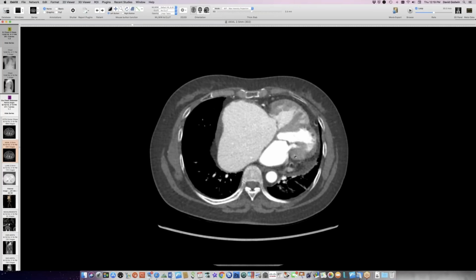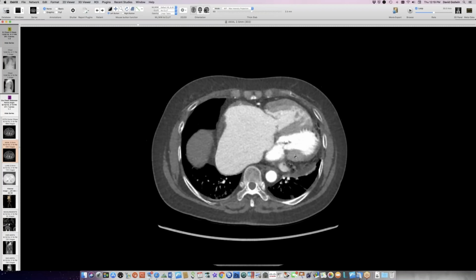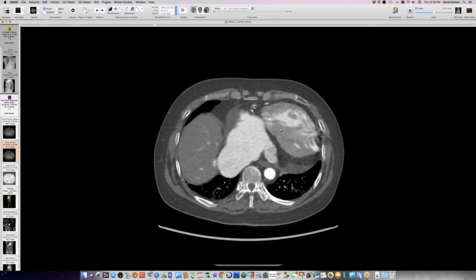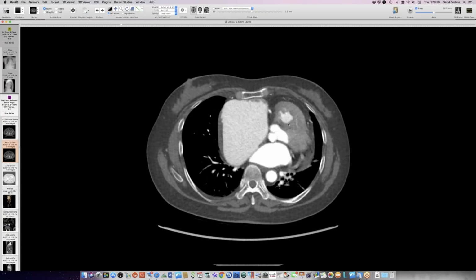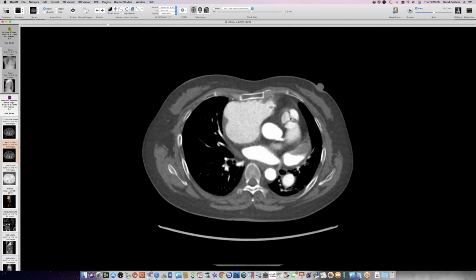I think you can see a jet of blood here from her mitral stenosis, and her tricuspid. So her tricuspid valve is thick, doesn't open all the way, and she's got all this hypertrophy, I think, of her infundibulum, and then a very thickened pulmonic valve as well. So the question was on echo whether she had congenital disease of the pulmonary valve or whether this was all rheumatic disease. The one valve that was spared was her aortic valve.